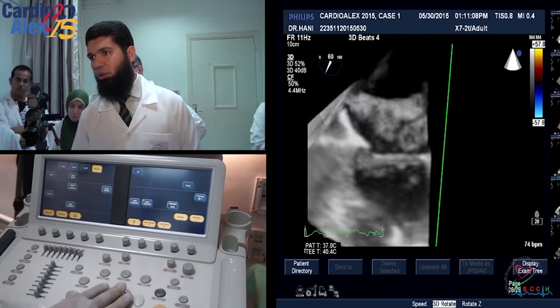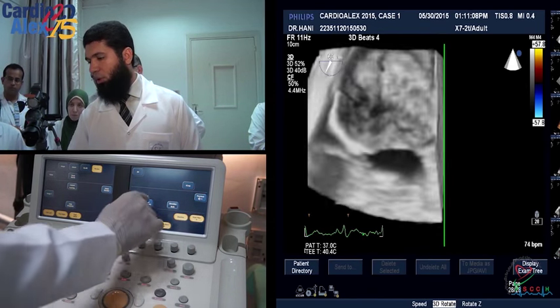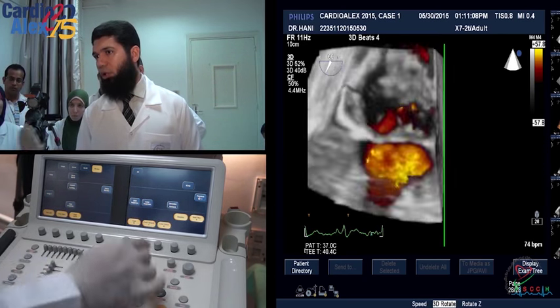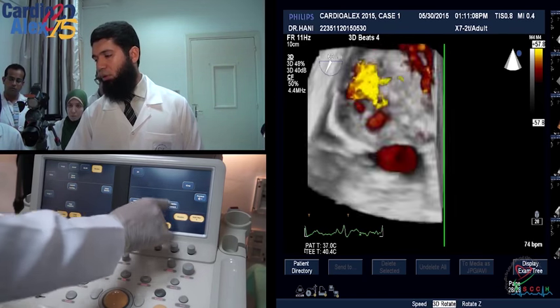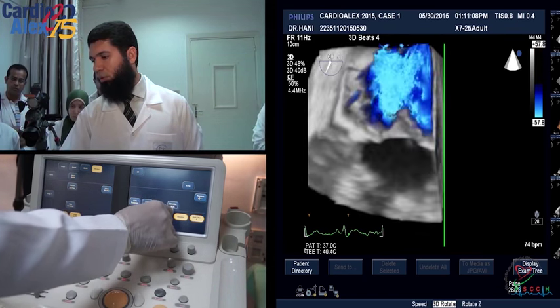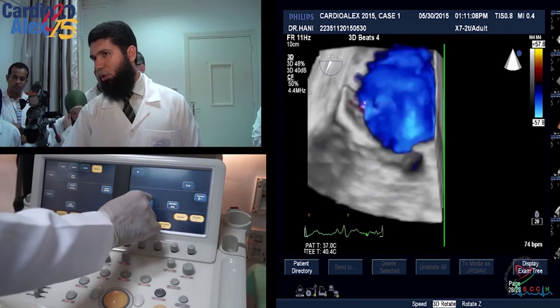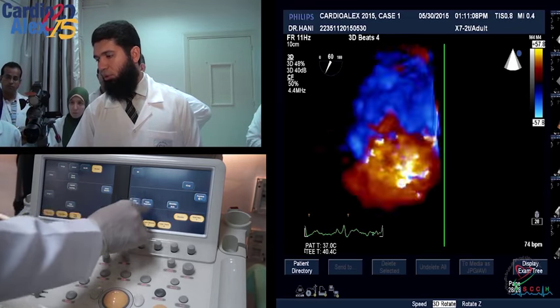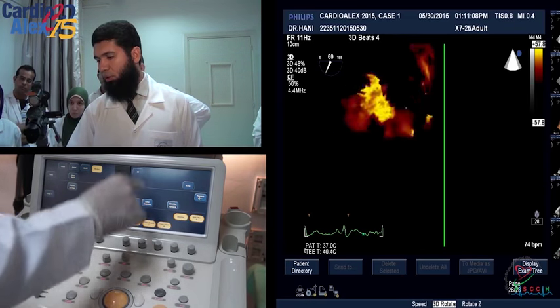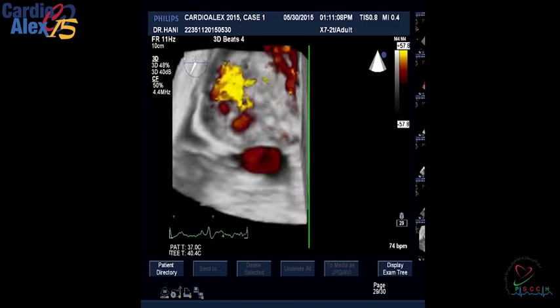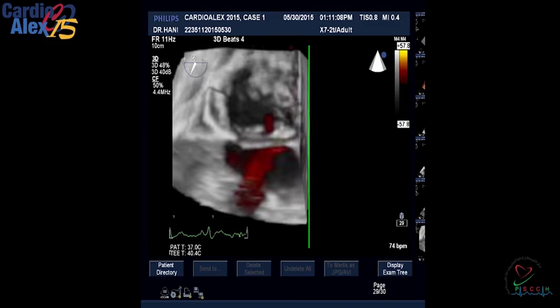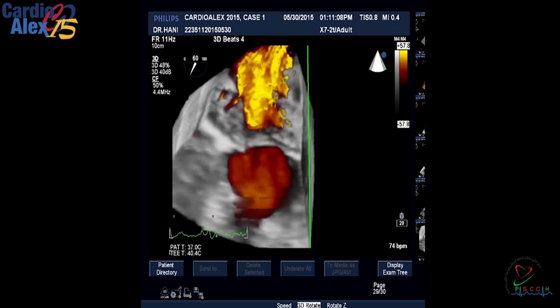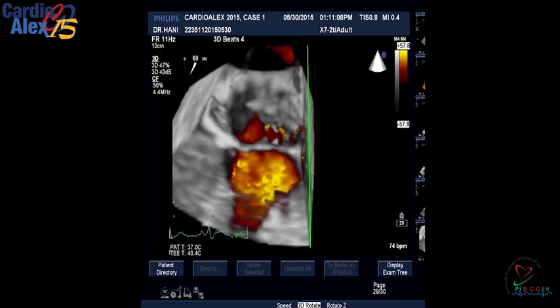With color Doppler on Full Volume: I can suppress the color to see the anatomy alone, then put the color back. I can set the color to show only one direction — to show regurgitation only — or both directions. With the 2D image suppressed and color only displayed, this is the regurgitant jet. This allows visualization of the regurgitant jet in 3D Full Volume with color Doppler.